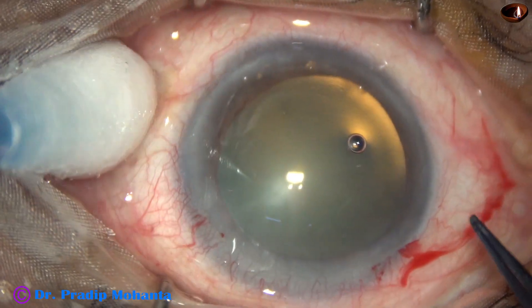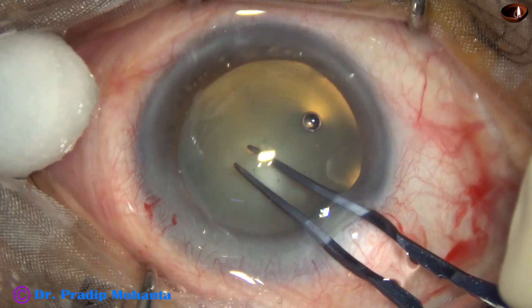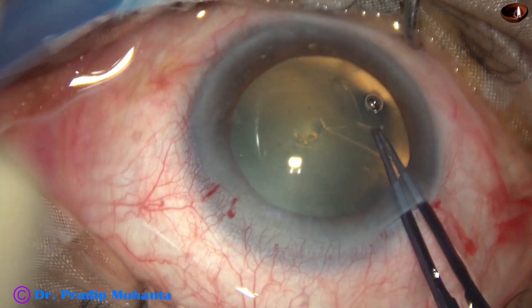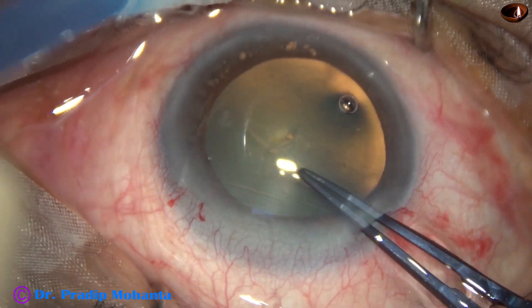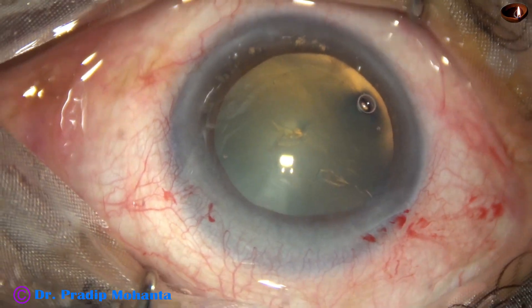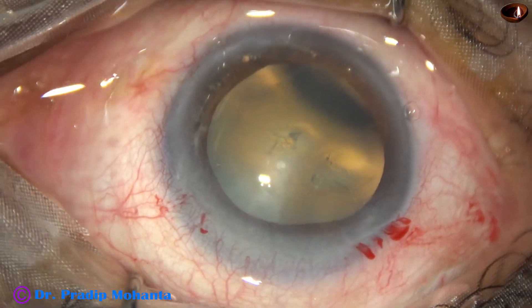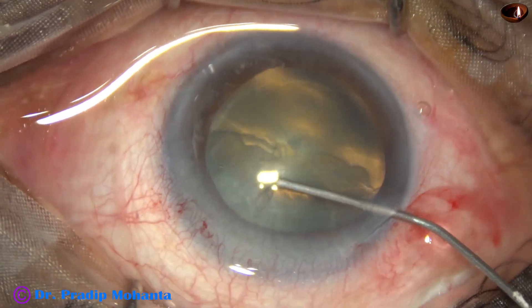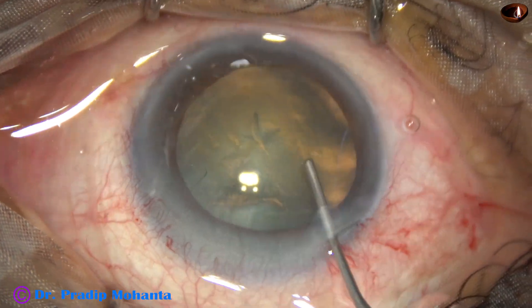Now capsulorhexis is done with the help of Utrata forceps. There is convexity of the anterior surface of the lens, so I did not want to do a large rhexis initially. However, we have to achieve a large rhexis by the end of surgery because capsular phimosis is quite common in cases with retinitis pigmentosa.